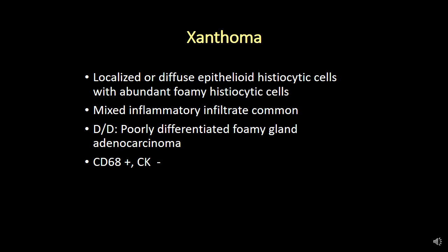Xanthomatous infiltration is relatively infrequent but it can importantly mimic poorly differentiated foamy gland prostate adenocarcinoma. Some helpful features here include a relatively bland appearance, though keep in mind that foamy gland adenocarcinoma can also have relatively bland cytological features. Presence of mixed inflammatory infiltrate is a useful feature, and in poorly differentiated foamy gland prostate adenocarcinoma you will have at least focal glandular differentiation. It is a good idea to do both CD68 and cytokeratin to support your diagnosis.